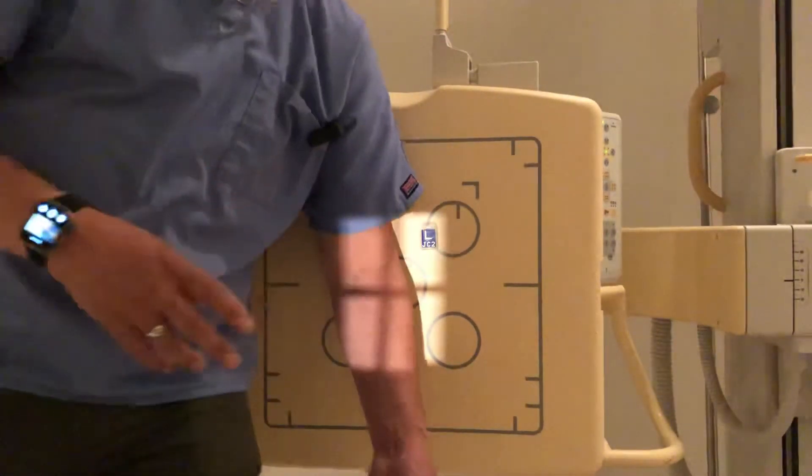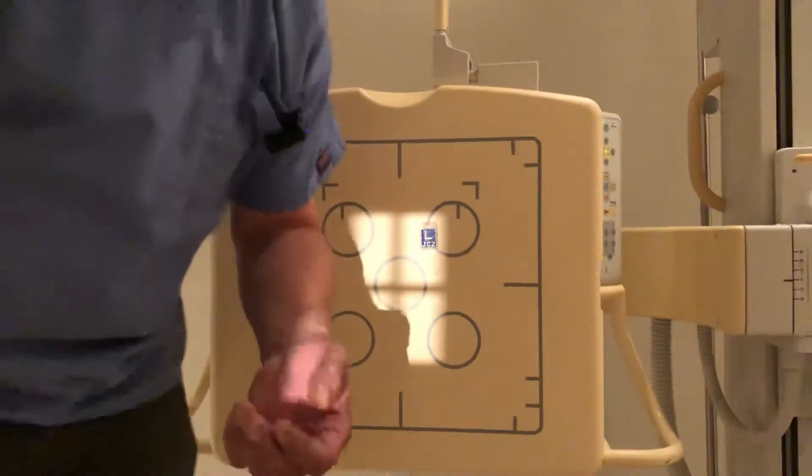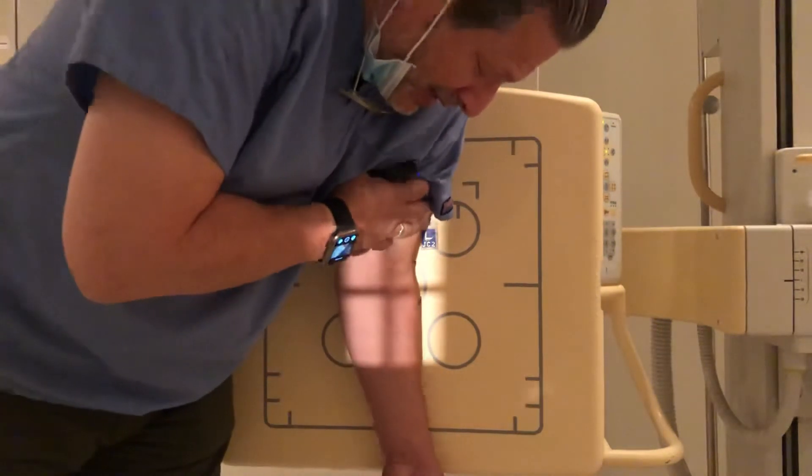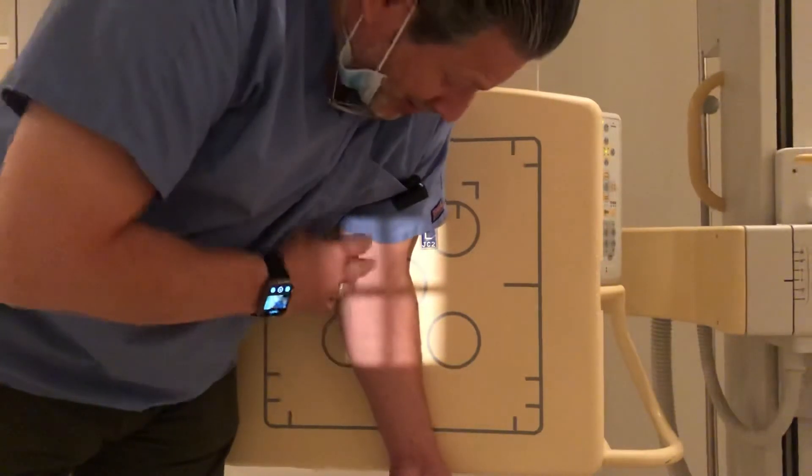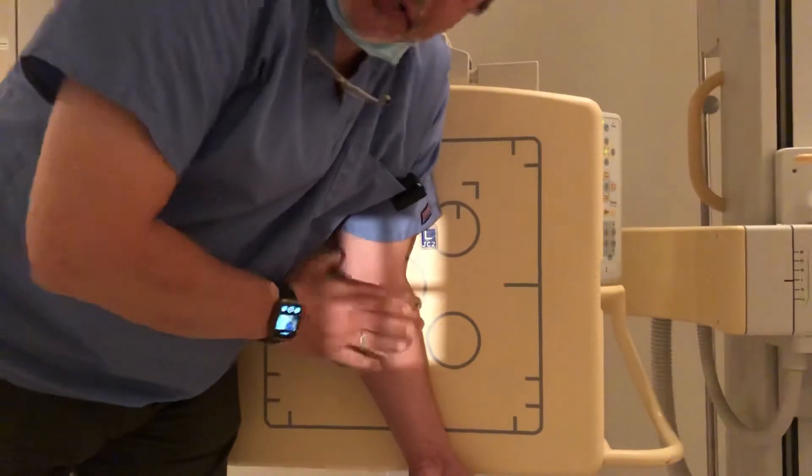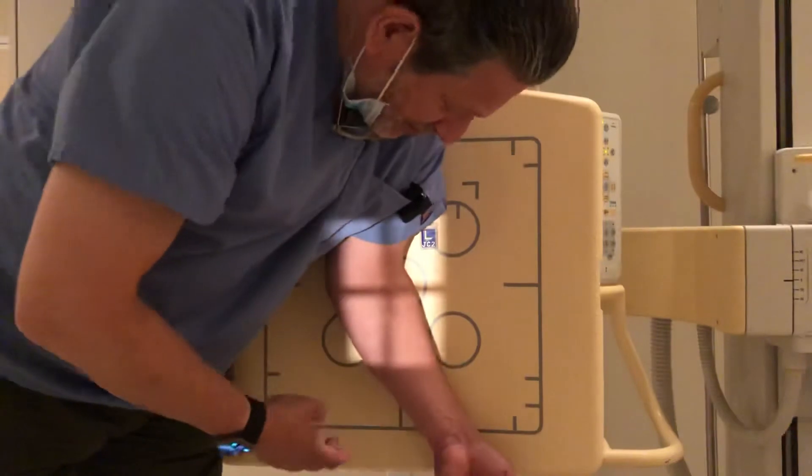Once you've done those two views and the patient's still like this, then you want to, from this view, have them turn in a little bit to get a 45 degree angle of the radial head. So they're usually coming in about 30 degrees, you're just going to go about 15 more, get in this position.